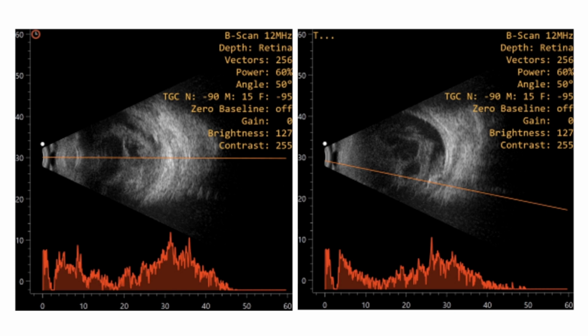The scan passing through it shows a high reflective membrane echo, with a retinochoroidal abscess probably. What do you see post reverberation? A foreign body shadow. It's even seen in this left side image also. You can see foreign body shadowing.